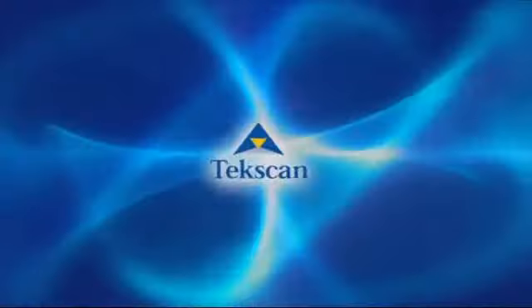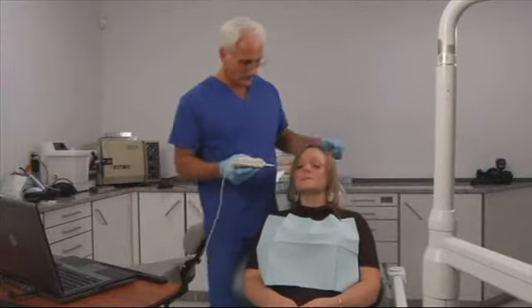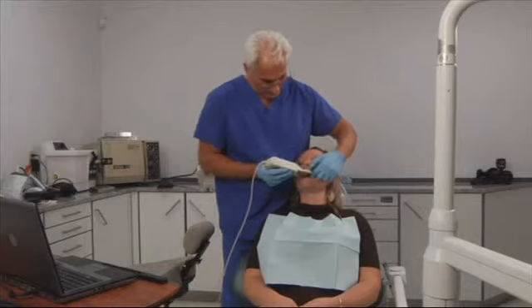So now that you've come back after a week, I'm going to remeasure you just as we did before to check your occlusion and your disclusion and do any subtle corrections to make it optimal. I'm going to have you bite down on the sensor again, but I just want to make sure that we have a good recording level for you again.